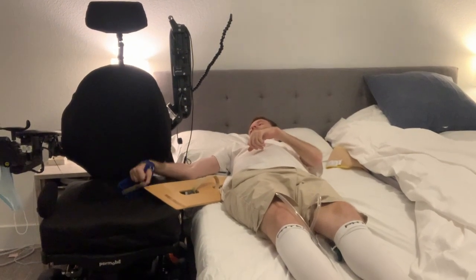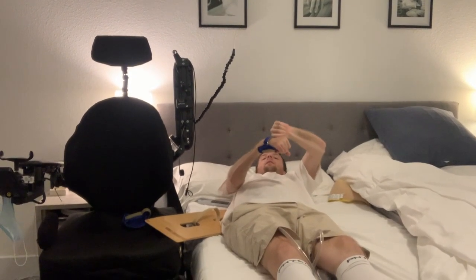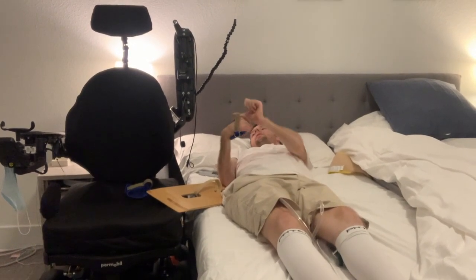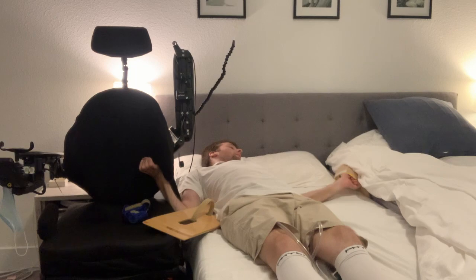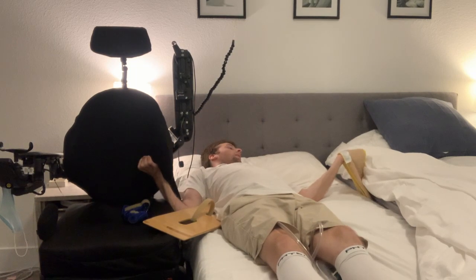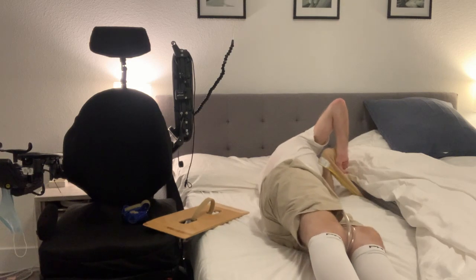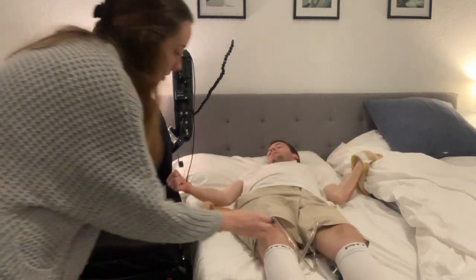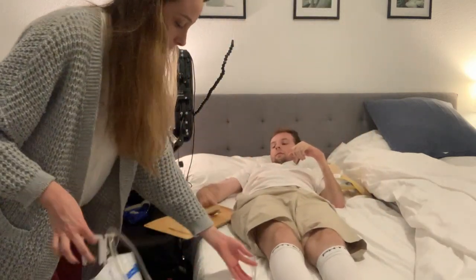Since I've parked my power chair right next to my bed — that's where I keep it when I sleep — I can turn in the middle of the night by myself. On the other side I've got a Posey strap hooked underneath the bed around a rail, so it's super sturdy, and I can roll that way to get completely off my butt.